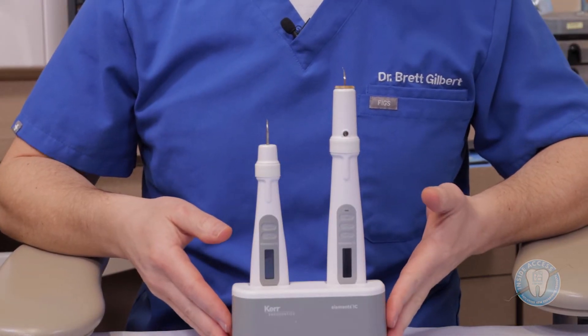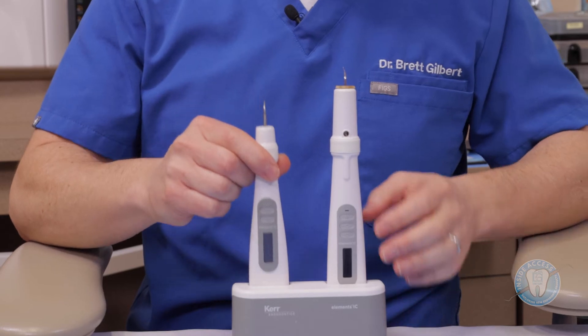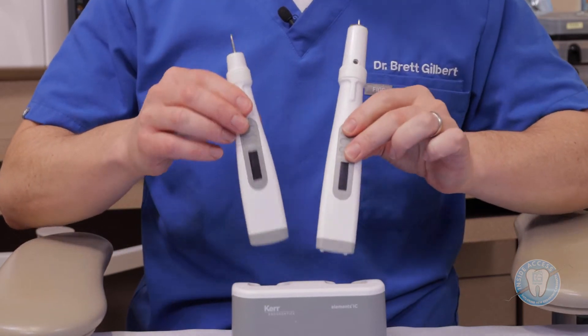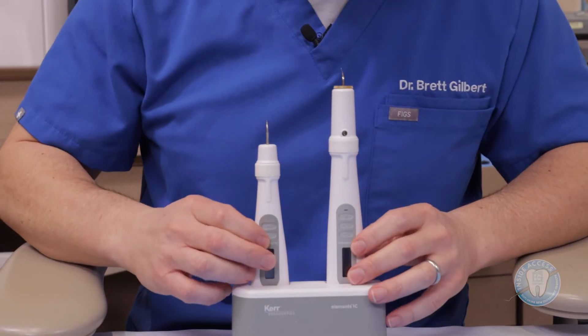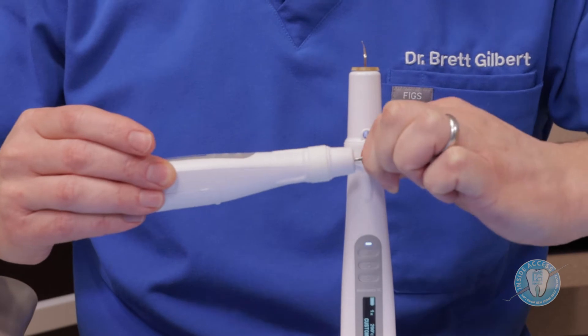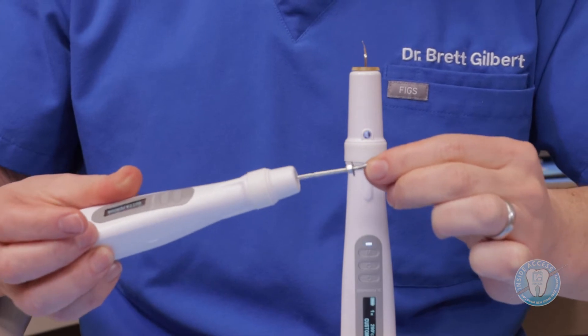I want to introduce you to the Elements IC, which is a great obturation system. It includes both a System B downpack unit as well as a backfill obturation unit. A couple of unique features here: the cradle is very easy to withdraw and replace the units. They have a special contact charging port on the bottom that allows just contact with the plastic to allow the charging to occur. When you power up the units, you'll see they have a nice light-up display. With the downpack unit, you have System B tips which are removable, so you have different sizes and tapers for your obturation.